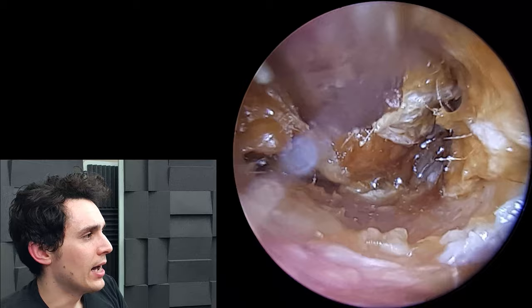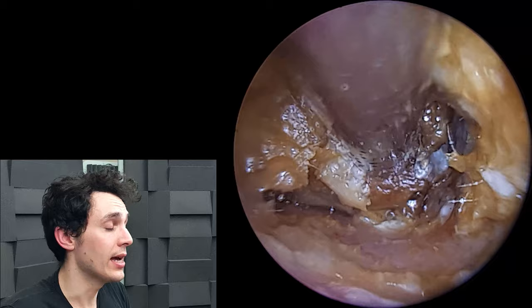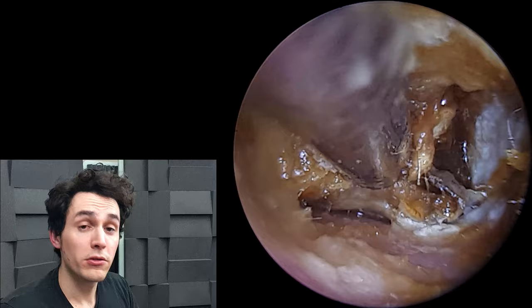The second half will show the same patient, the same ear, but ten days later after they've had the Otomize. Just here you can see some white debris on the right hand side — I don't think that's fungal growth, I think that's just desiccated skin.